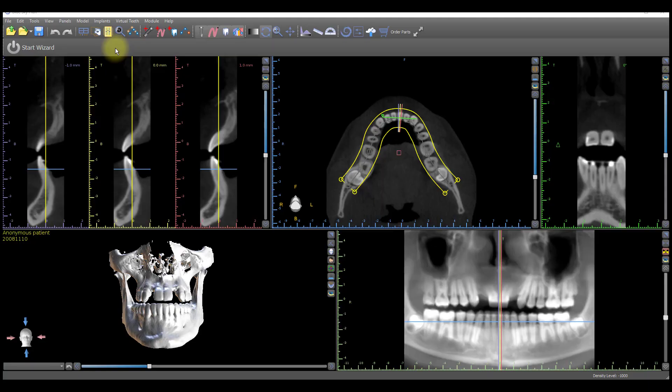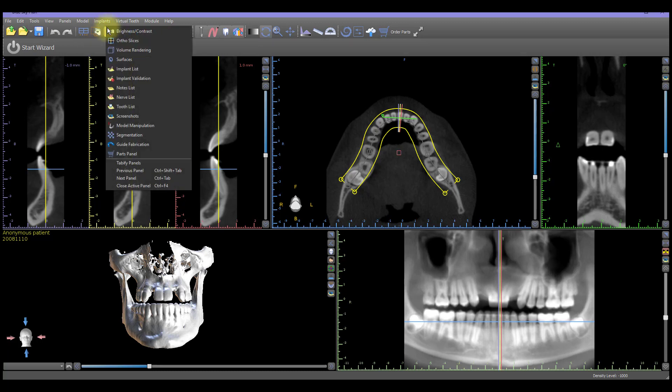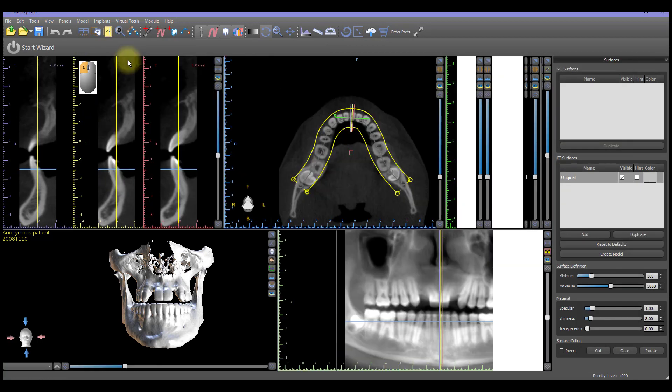To separate jaws in cases that include both upper and lower arches, the Cut function is used. The Cut function is found in the Surfaces panel. To open the Surfaces panel, left-click on the Panels icon on the main toolbar, then left-click on Surfaces.